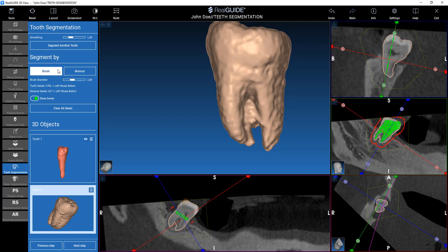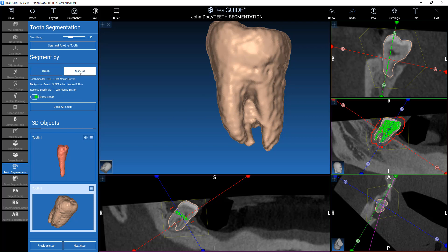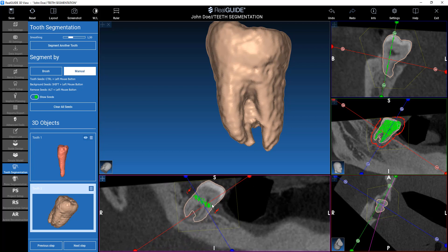We can use the manual tools here. Manual tools enable us to correct the seeds. The seeds we see here can be tooth seeds or background seeds. Tooth seeds are the yellow seeds you can see here, and background seeds are the red seeds. Basically, for the software, everything that is red is not a tooth, and everything that is a tooth seed is a tooth.